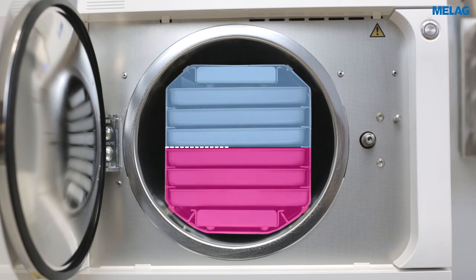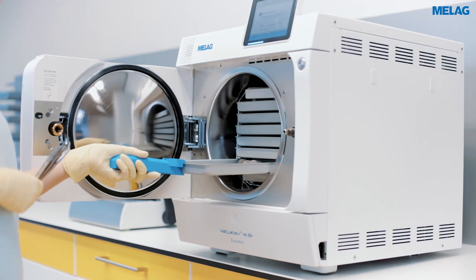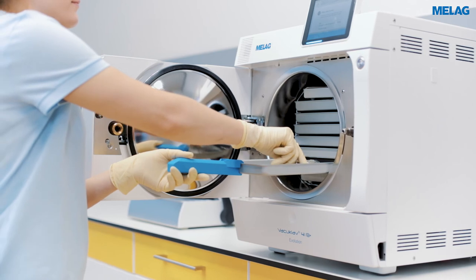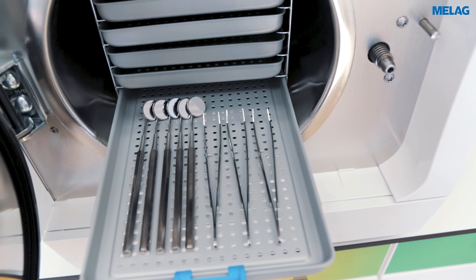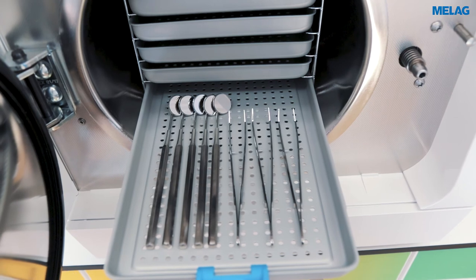The following loading instructions lead to even better drying results. Instruments in transparent sterilization packages or paper bags should be sterilized at the top of the chamber. The heaviest load elements and unwrapped instruments are placed below. The perforated Melag trays ensure ideal drainage of condensate; the use of additional paper inserts is not required.